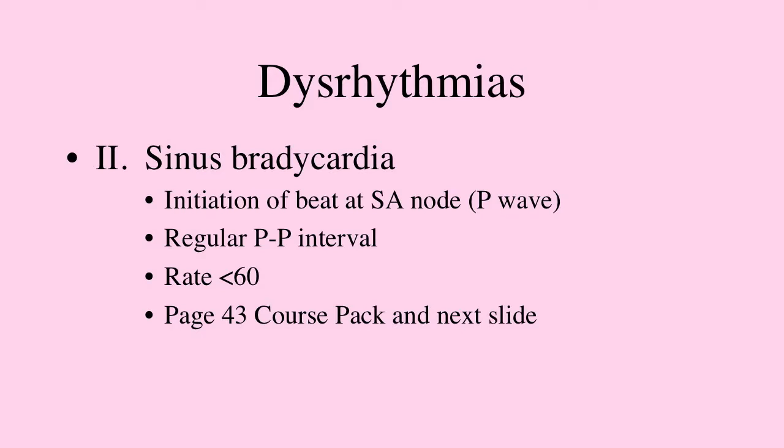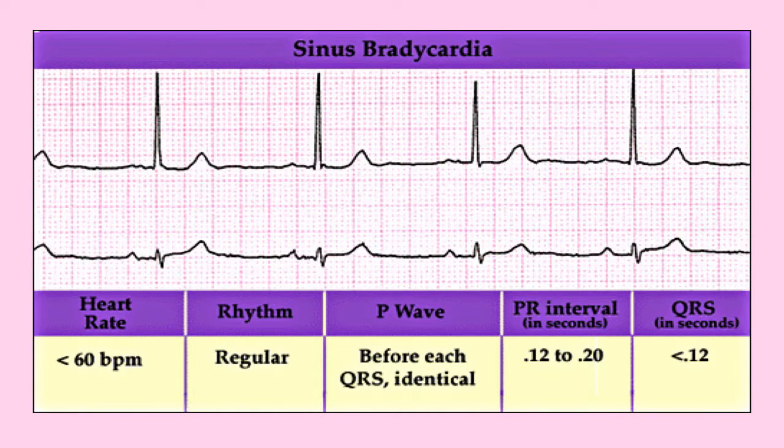So sinus bradycardia. You can also say sinus bradycardia is another way to say it. If you look to the next slide, everything is normal. There's just a slow heart rate, less than 60, and that's sinus bradycardia.